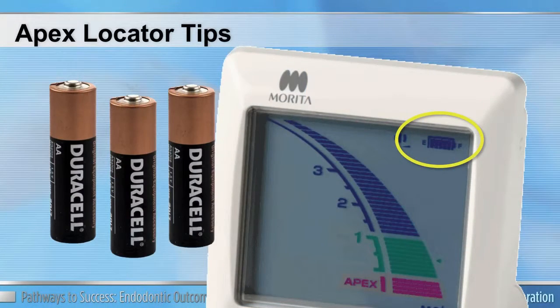The first thing to remember is that your apex locator is powered by batteries. Always look at your meter and make sure your power is greater than half of the bars. If your battery strength goes below halfway, the accuracy of your apex locator can be compromised. A simple tip: every time we change our clocks, we should change the batteries in our apex locator.